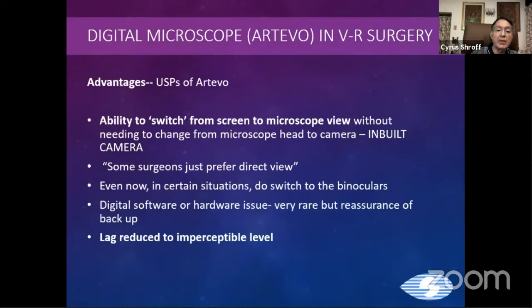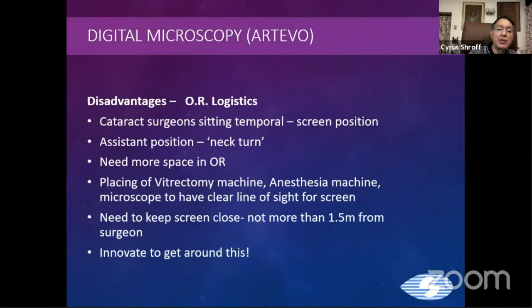This is the inbuilt camera. Some surgeons just prefer the direct view. Even now, in certain situations, we do switch to the binoculars. And even on the question of digital software or hardware issues, in the rare occurrence that there is a breakdown, you have the reassurance of the backup of the binoculars. And in this system, the lag is reduced to an imperceptible level.